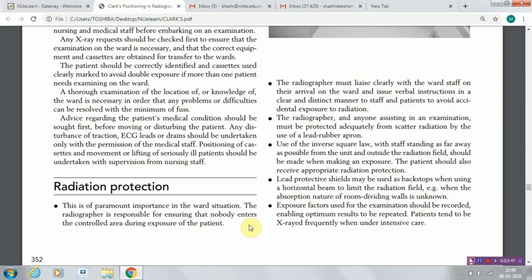One important factor is explaining to the patient. If unconscious, when the patient is on a ventilator, you cannot do anything, but if the patient is able to understand, not unconscious, sometimes post-operative, sometimes a suspected fracture, at that moment when you take a radiography, you should properly explain. That's the most important part.